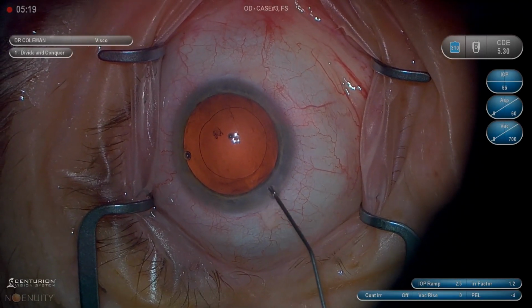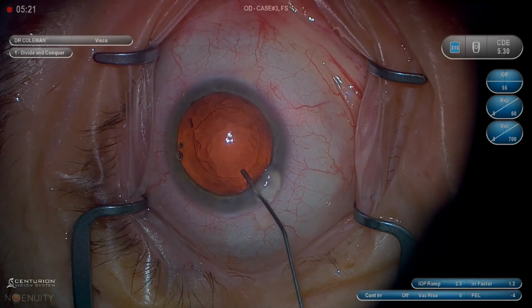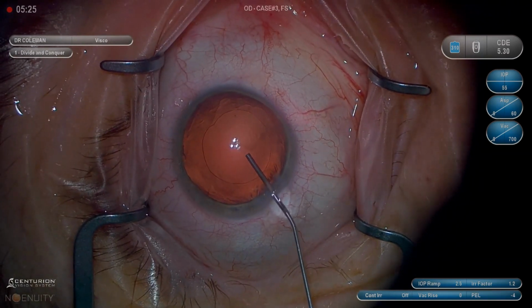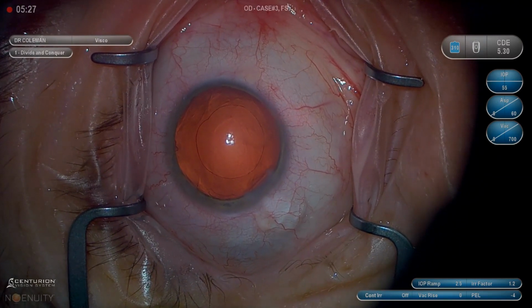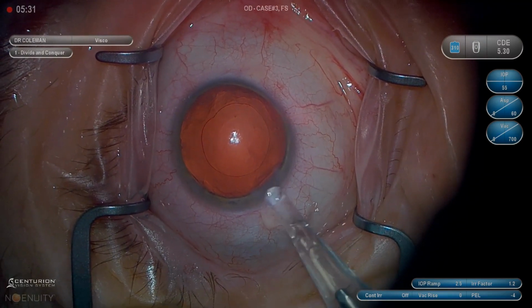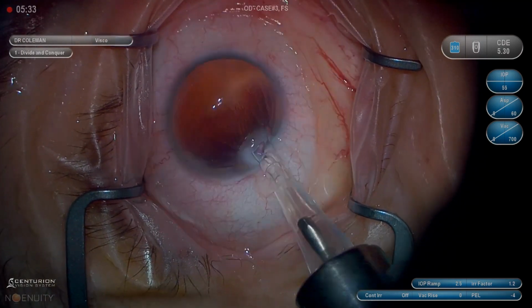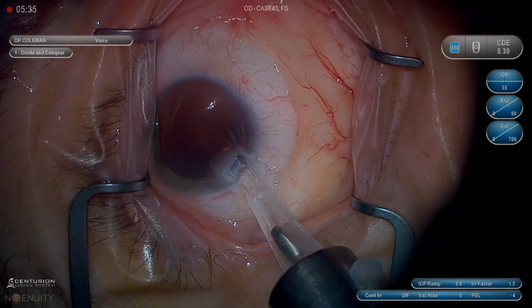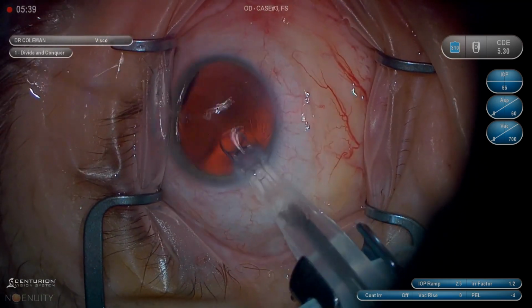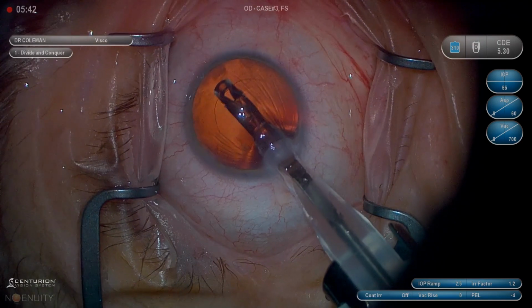This is Dr. Wyche Coleman, video 6 of 6 in the basic cataract series. And this is basically the final steps of cataract surgery. We've gone through separately making incisions, capsulorhexis, hydrodissection, nucleus removal, cortex removal, all using the divide and conquer technique. So this is closing up, and the interesting thing about this is the longest video.